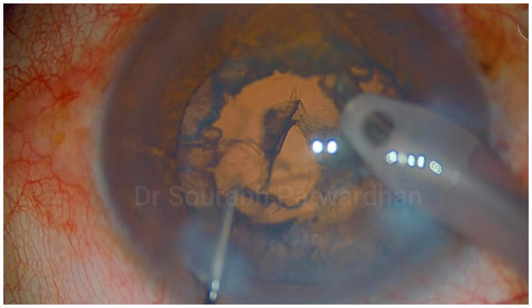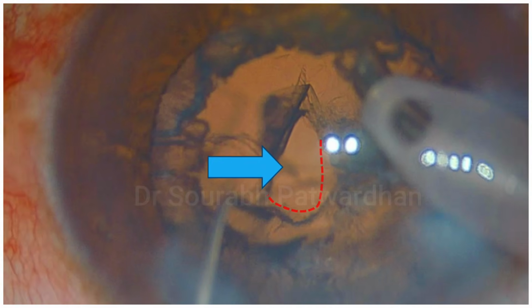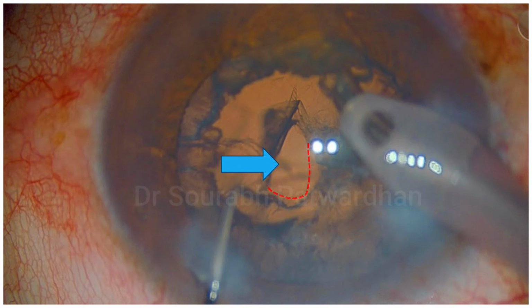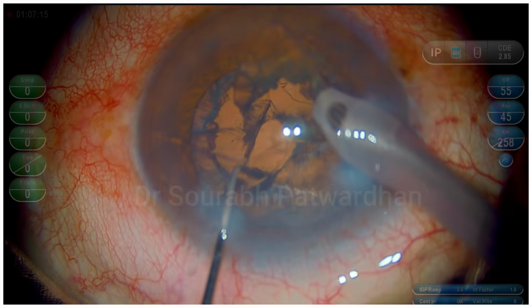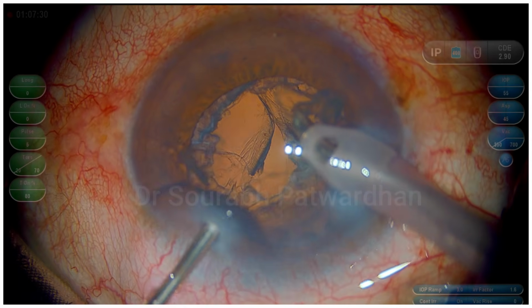You can see that there is a sharp margin which I could notice on the posterior capsule, and also I could see some small cortical material which is deeper than the posterior capsule, and this is why I got distracted and caught hold of iris.